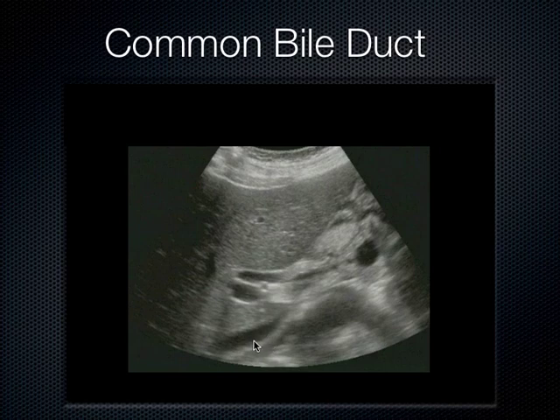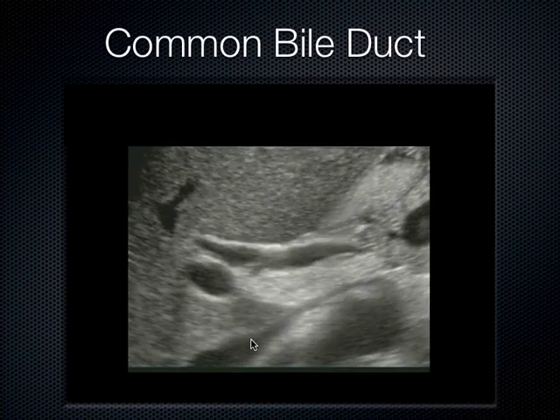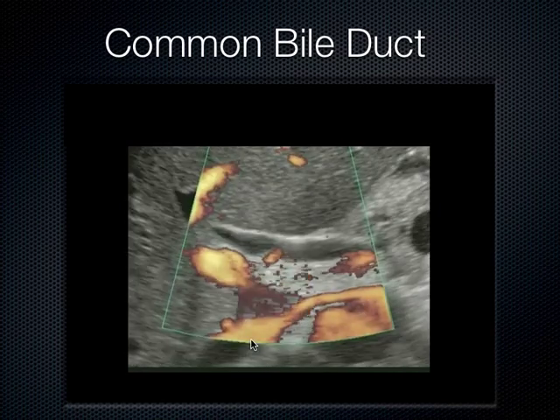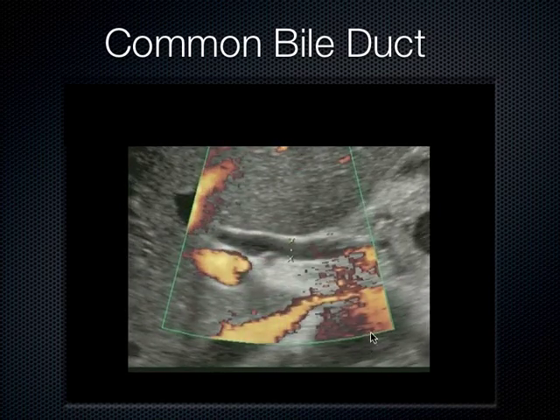Anybody want to take a stab at what this is down here? Good, IVC, exactly. So as this video goes along, we zoom in, and then just for fun, we throw some flow on this stuff. So this is the aorta actually right here, and the IVC. This is the left renal vein coming over and dumping into the IVC, just right on top of the aorta.